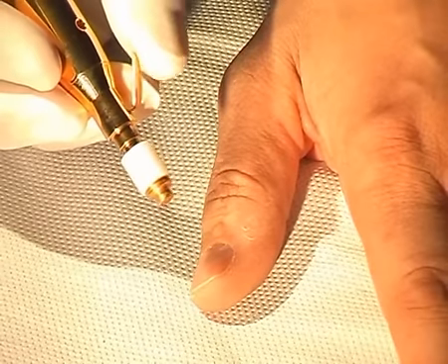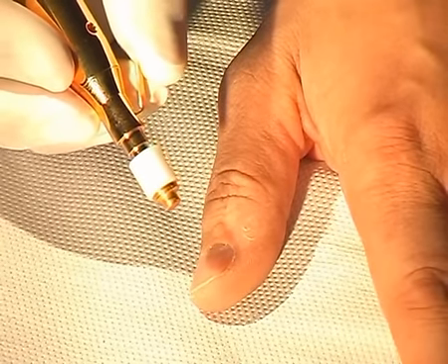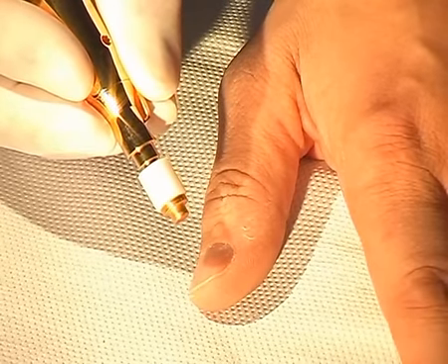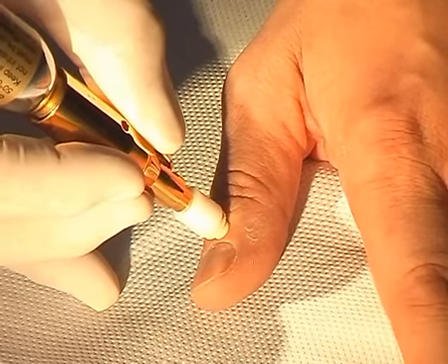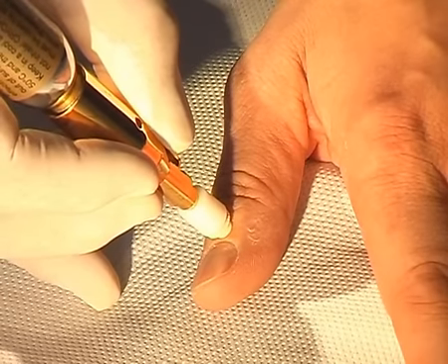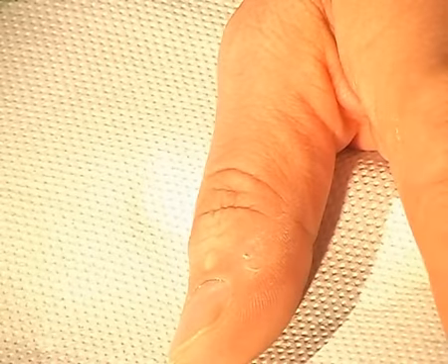This patient, 53 years old, has a flat wart on the left thumb. We are removing this wart with a 5 mm contact applicator, which is, as shown before, cooled down for 10 seconds, and then we are treating for 5 to 6 seconds. The reaction of the patient shows that he feels no pain at all.